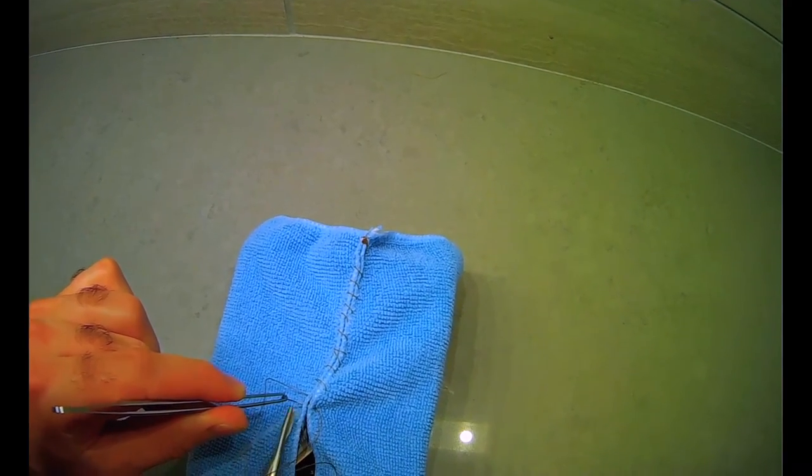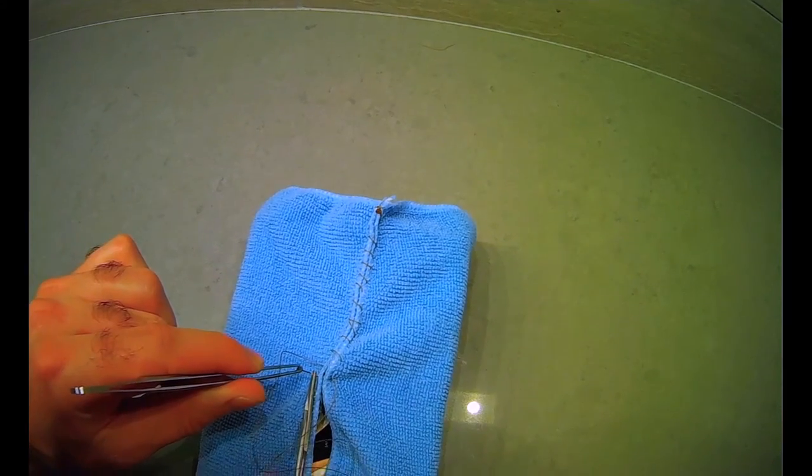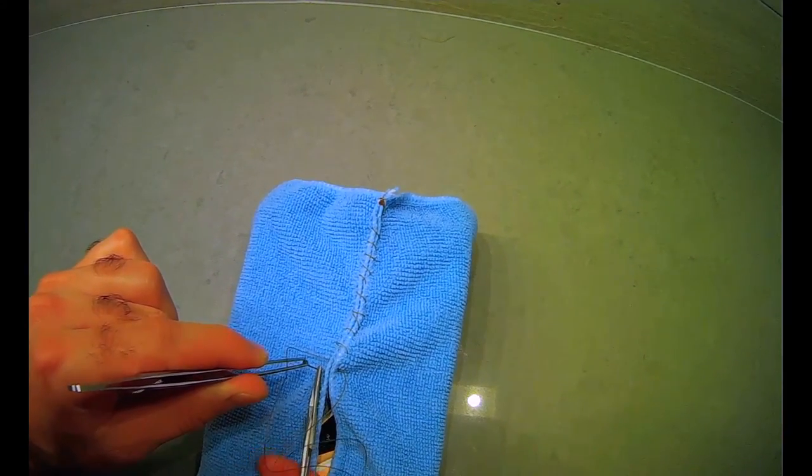And this is really what you need the most practice doing, is unlocking, locking, getting tangled with your suture, reloading things as you go through the skin, and pulling it through.